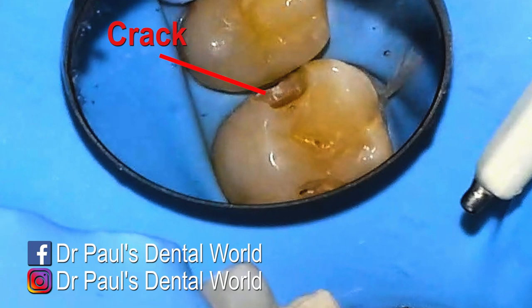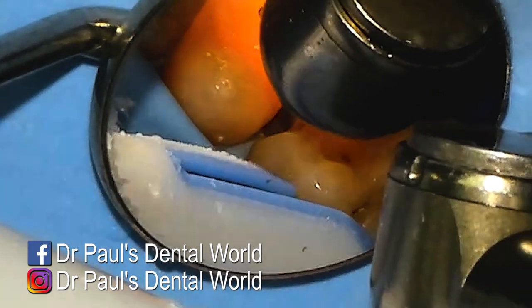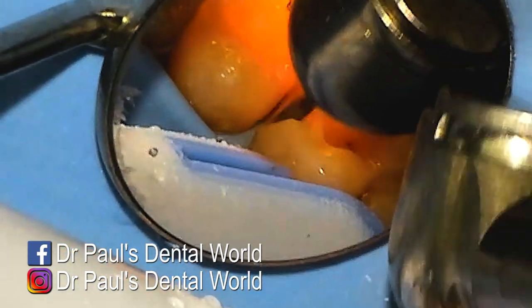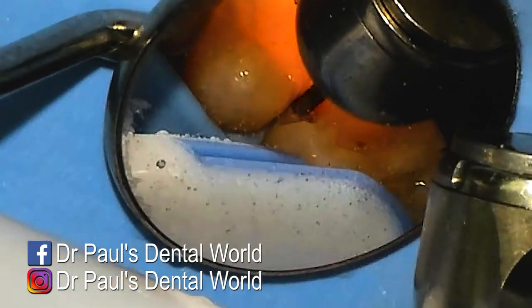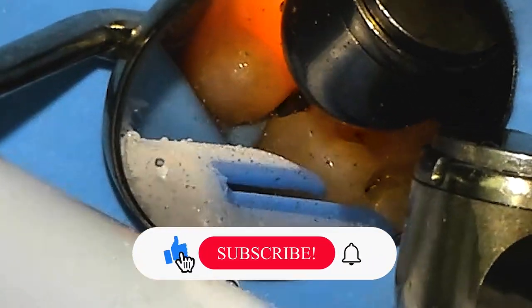The only problem is that crack — I can still see it in this front section of the tooth and I don't want that crack to be there, because if I can see it, it means that bacteria can definitely get inside. So I'm just removing a bit more in the area where the crack is.